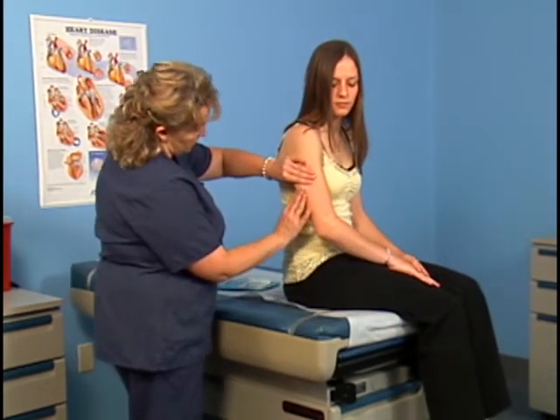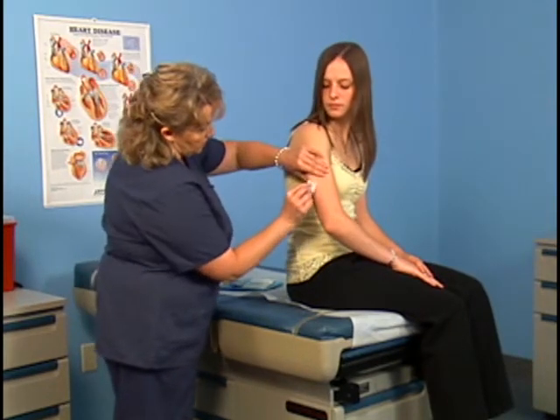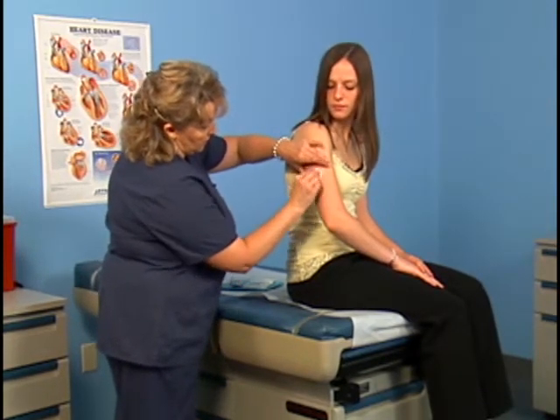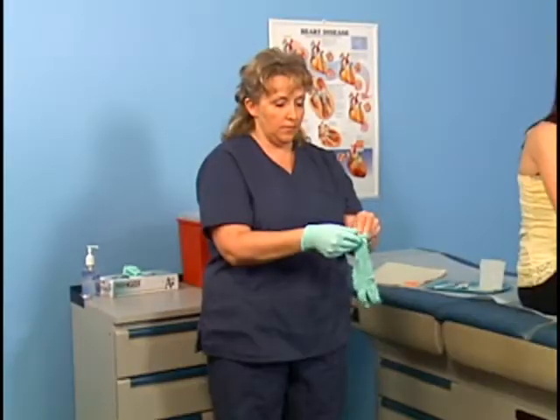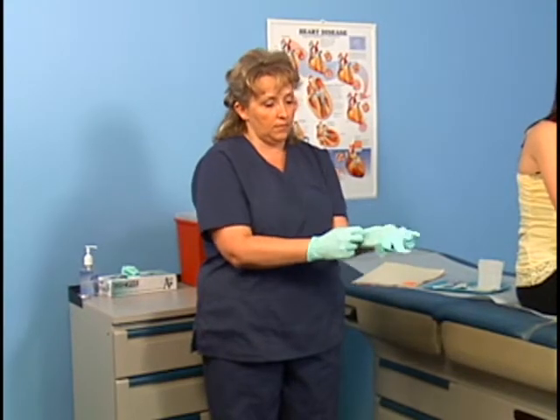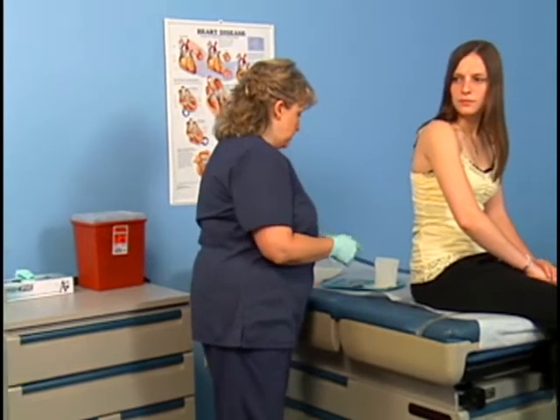Cleanse the site with an antiseptic wipe using a circular motion. Start at the injection site and move outward. Do not touch the site after cleansing it, otherwise you will need to repeat the cleansing process. Allow the area to dry completely, otherwise the wet antiseptic may enter the tissues when the skin is pierced, resulting in irritation and patient discomfort. Apply gloves to protect yourself from blood-borne pathogens. Remove the needle guard.